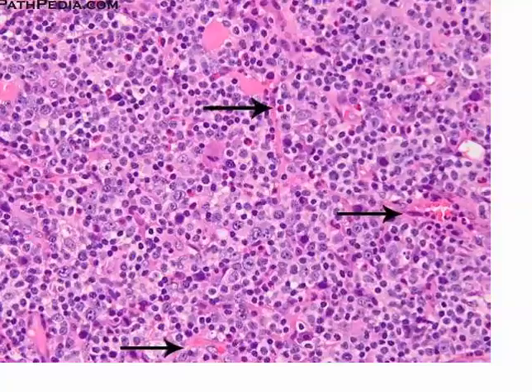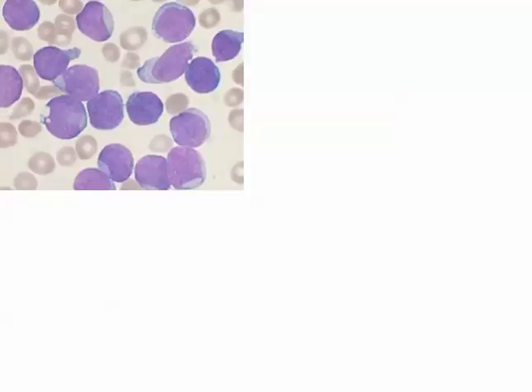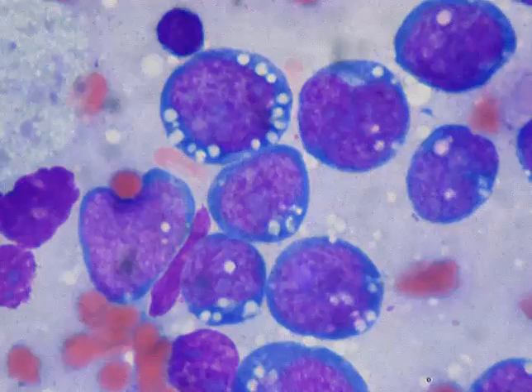And then there is the small lymphocyte lymphoma. This is small lymphocyte lymphoma, and also mantle cell lymphoma. Here we can see mantle cell lymphoma. So while Burkitt's lymphoma is quite rare in Western countries, it is common in Africa among children. So remember that.